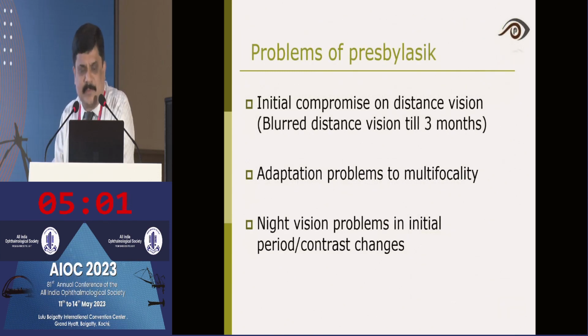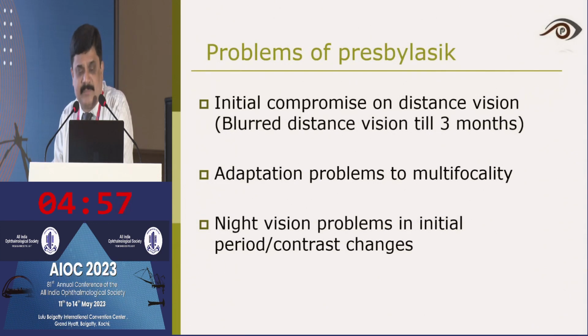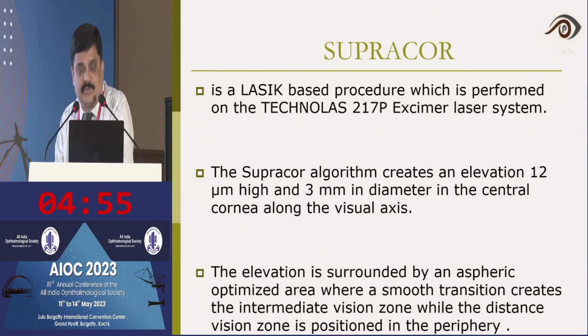So these are the problems with Presby LASIK: initial compromise of the distance vision, adaptation problems, and night vision problems. They used to complain.